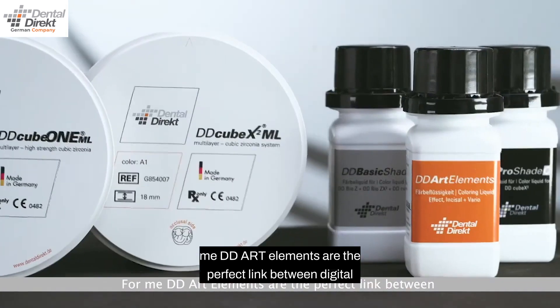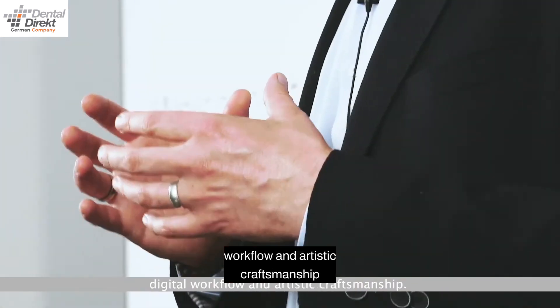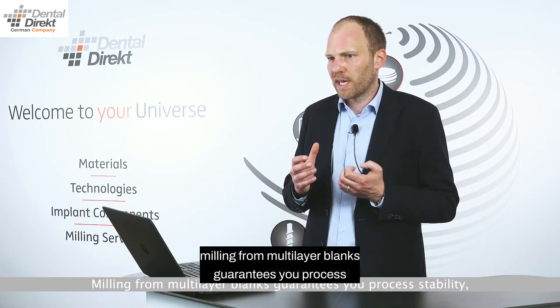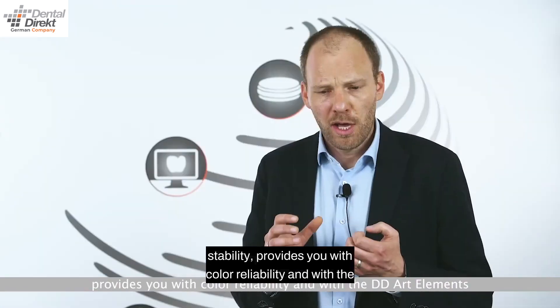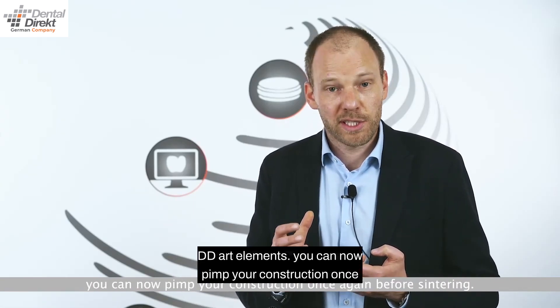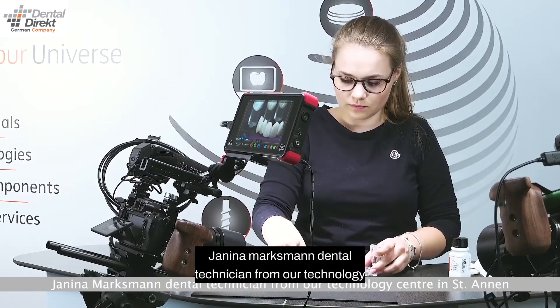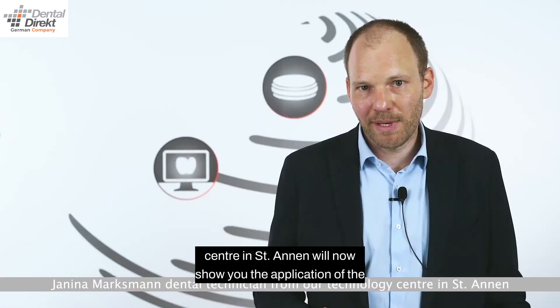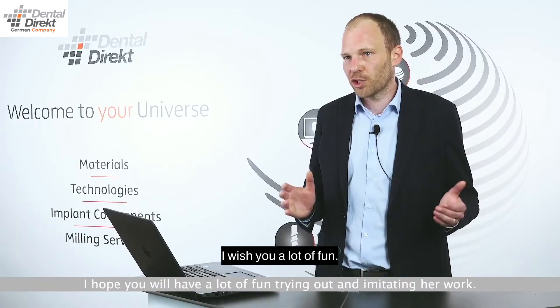To complete the liquid system, we also have the DD Art Elements. For me, DD Art Elements are the perfect link between digital workflow and artistic craftsmanship. Milling from multi-layer blanks guarantees process stability and color reliability, and with the DD Art Elements you can pimp your construction once again before sintering. Janina, a dental technician from our Technology Center in St. Annen, will now show you the application of the liquids on multi-layer blanks.